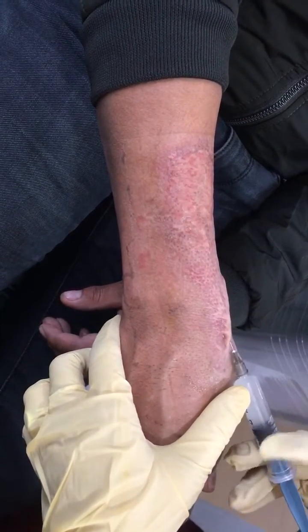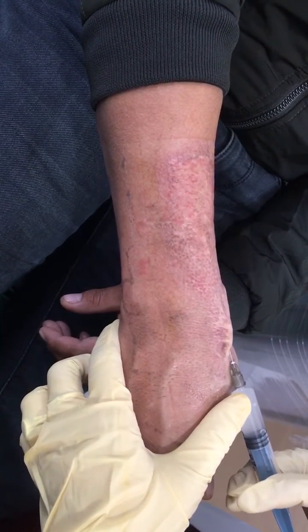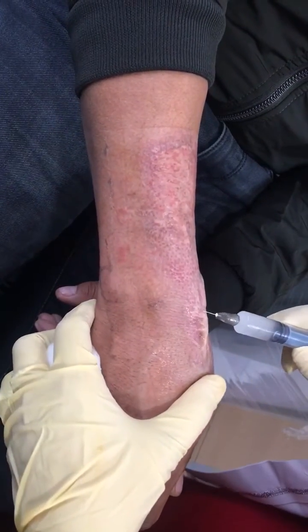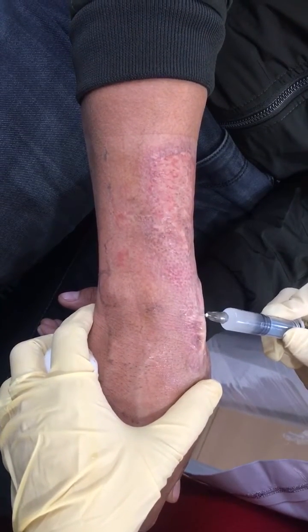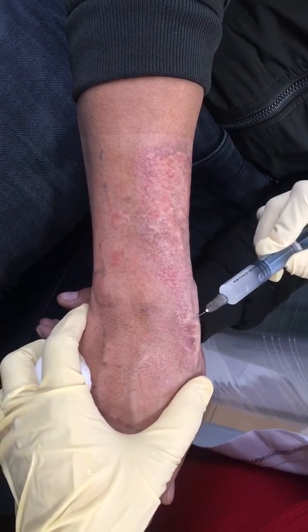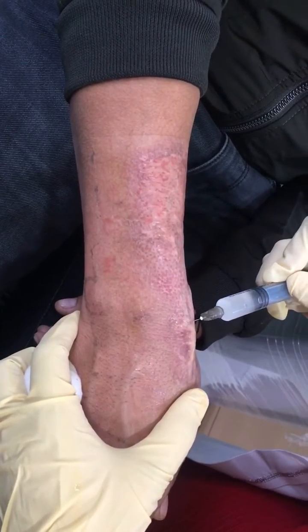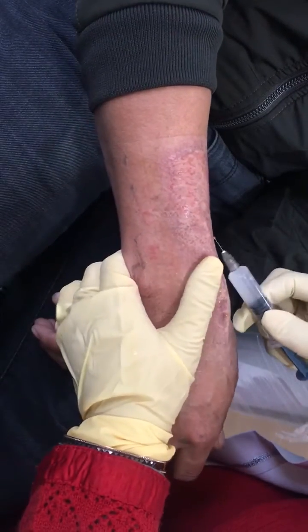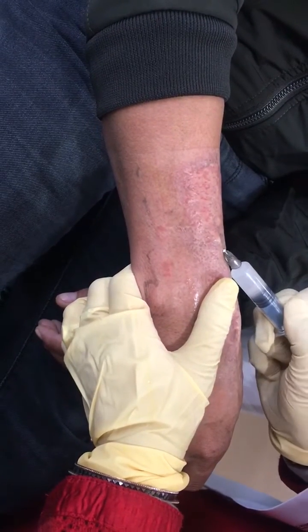First we will draw back and then push the solution slowly to be sure that we are not in any vessel. We will cover all the thick areas of scar. I am touching only the thick areas of scar.